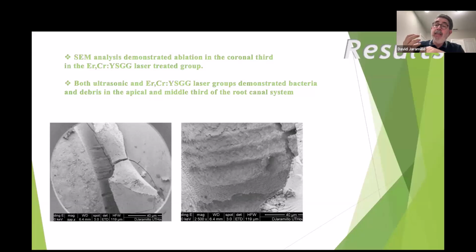So in order to help this laser to be absorbed better in the water, we need to keep higher parameters, more watts, more millijoules, more microseconds, or less microseconds. But the problem by doing this is that it turns the event into a thermal event.